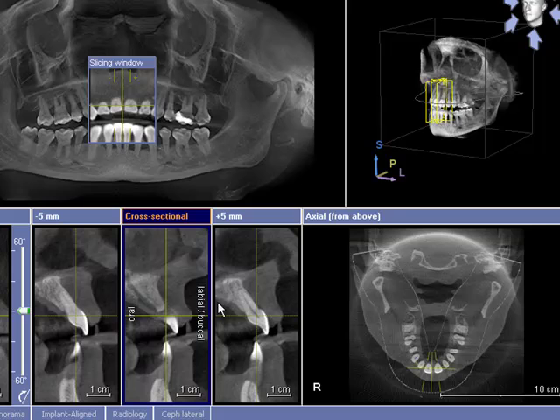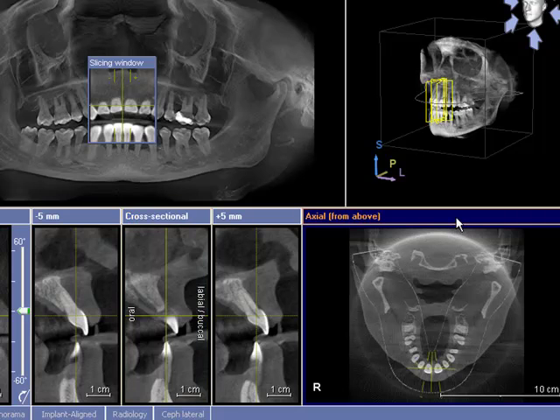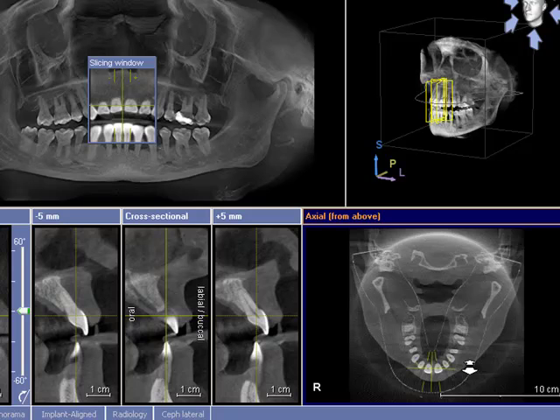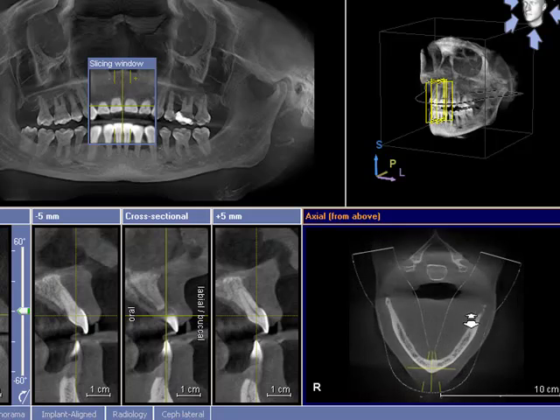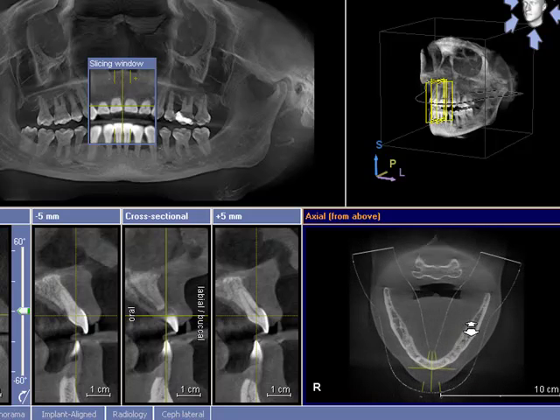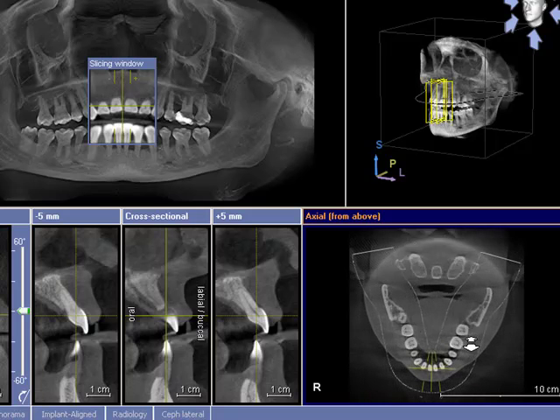You can do this with your axial image as well. Click on the window — it'll go dark blue and orange — left mouse click and hold, you'll see the arrows again pointing up and down, scrolling up with the mouse and scrolling down.